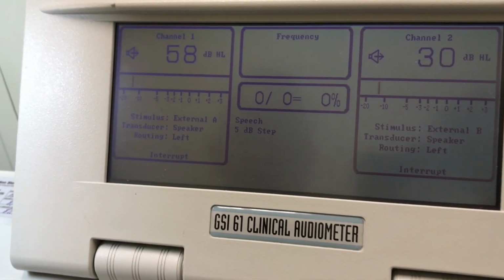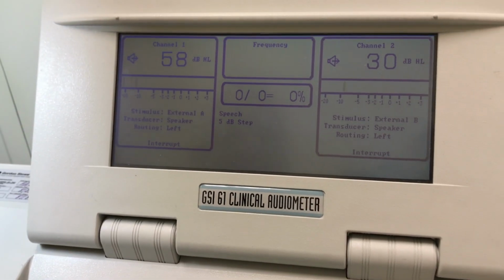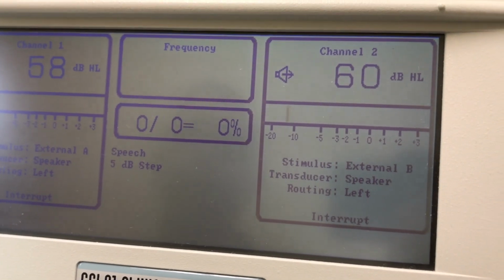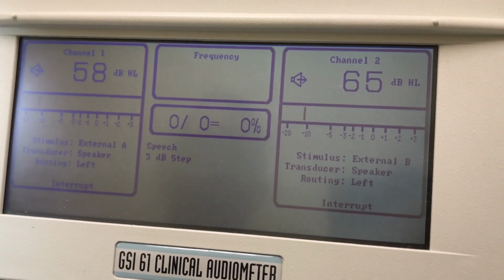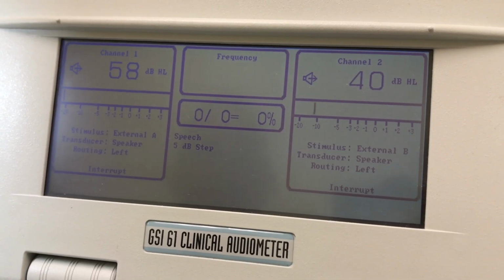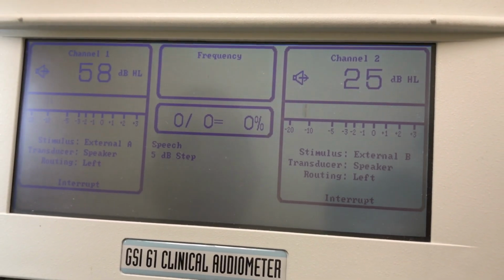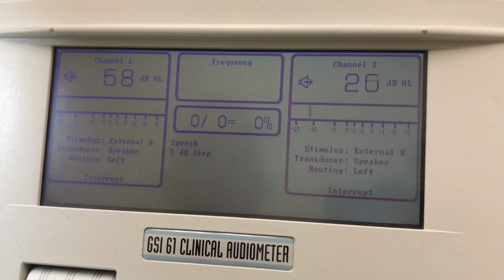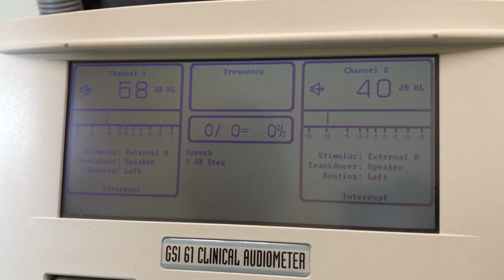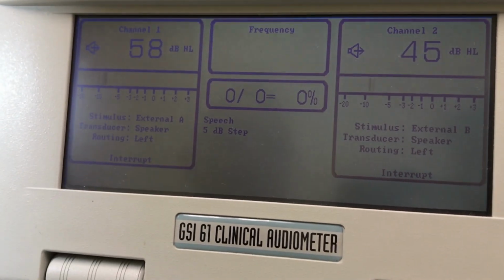Keep that interrupter switch on for channel 1 so that they're listening to the story about the man's trip to Arizona, and then we're going to increase the background noise level in channel 2, as you can see, until it gets too loud for them. When it gets too loud, usually this doesn't have to go much above their most comfortable listening level before they tell you it's too loud for them to still be able to listen to and follow the story. We decrease the intensity in 5 dB steps until it's very soft, and then we go back to increasing it, and they are telling you each step of the way to turn it up or turn it down until they reach the maximum level that they would be willing to put up with while still following the words of the story.